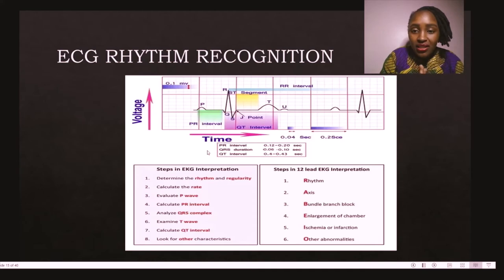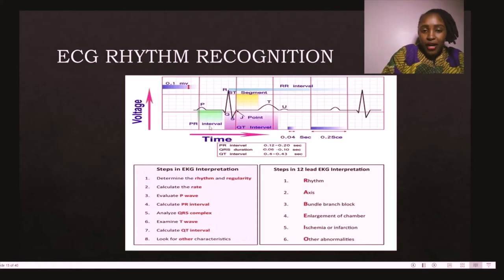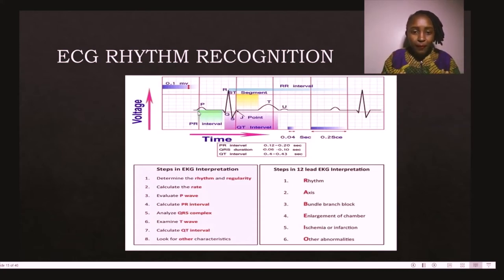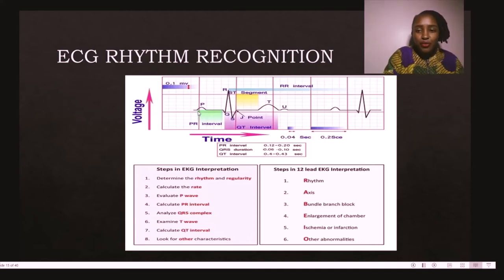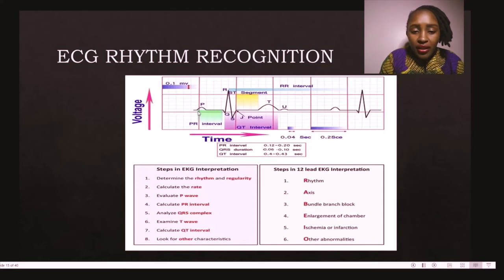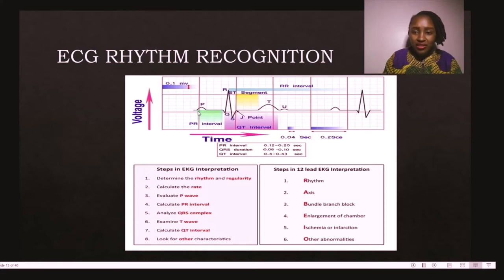The second step is to calculate the rate, based on the R wave. There are three ways to calculate the heart rate and I will show you those. The easiest and most accurate uses the small boxes. Third is the P wave — it should always be smooth and curved. If you see something that does not look smooth and curved, that indicates an issue coming from the atria. A P wave should always be followed by a QRS complex — if there are P waves but no QRS complex, there is a problem.